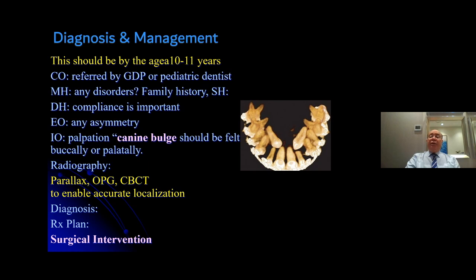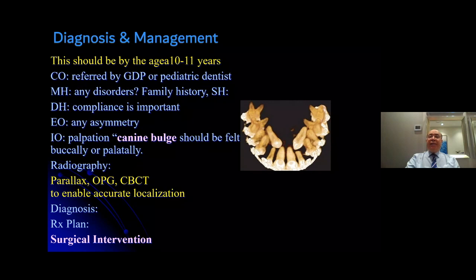In addition to the clinical diagnosis, it's very important to use radiological aids. The parallax, OPG and CBCT are very important, but nowadays we rely so much on the CBCT. And I would like to thank Dr. Ahmed Ghanema for doing the three-dimensional work for this presentation, because in some of these cases, without this 3D, it would be impossible to plan my surgery.